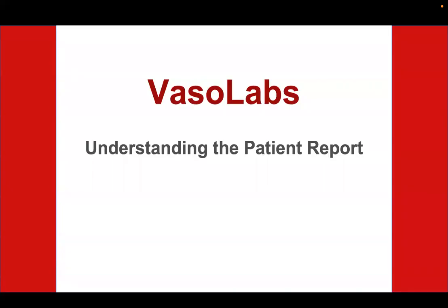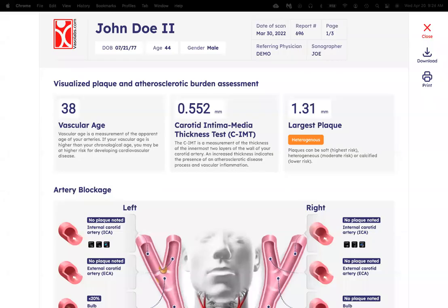With all that, let's now take a look at the new interactive VasoLabs report. Once you sign into your secure portal and click on your report, this is what will come up.